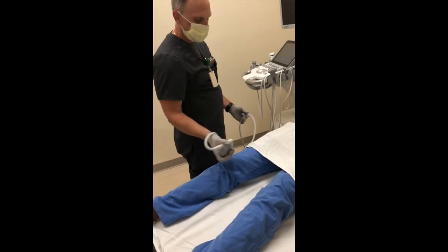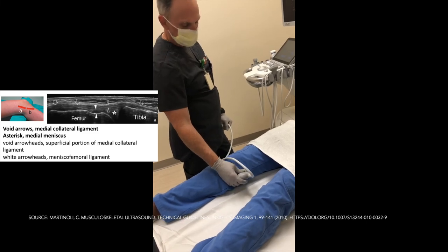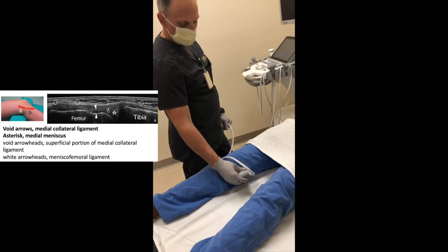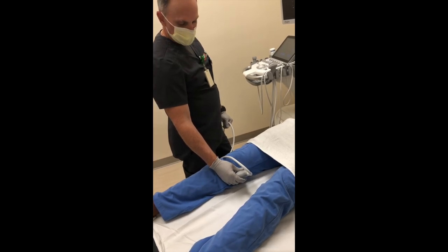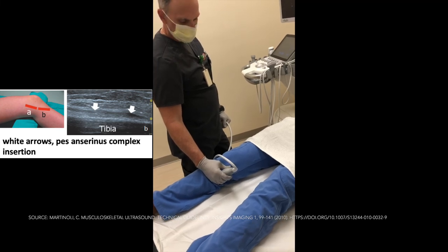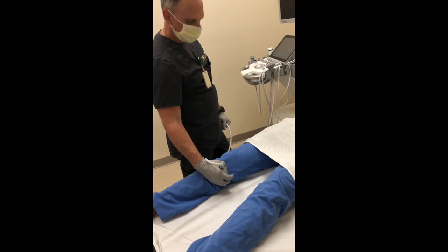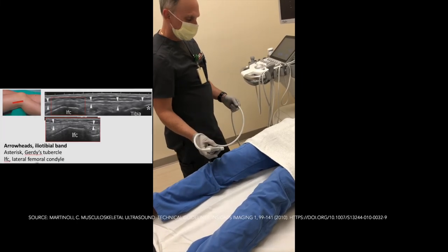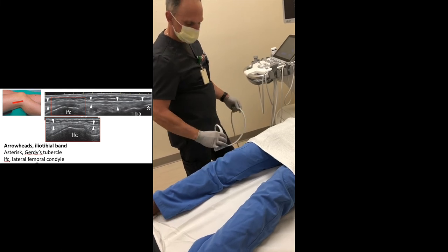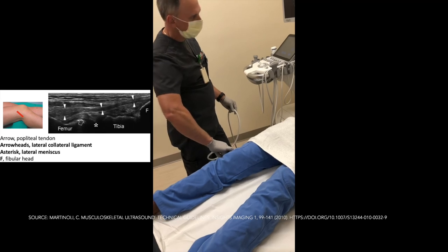Then either medial or lateral. From the medial aspect we can look at the joint line and the medial meniscus in long axis. If we go a little bit more distal, we can look at the pes anserine in long axis and also evaluate it in short axis. On the lateral side of the knee, we look at the lateral joint line and the lateral meniscus in long axis and also in short axis.